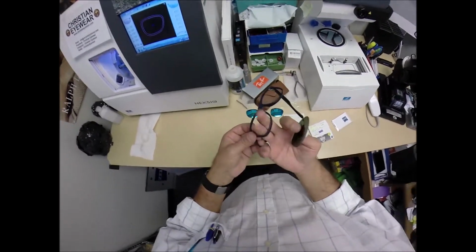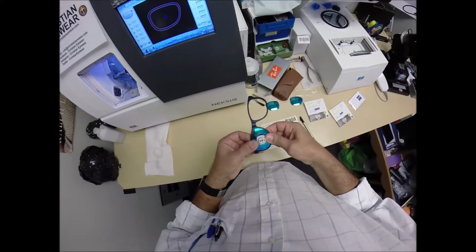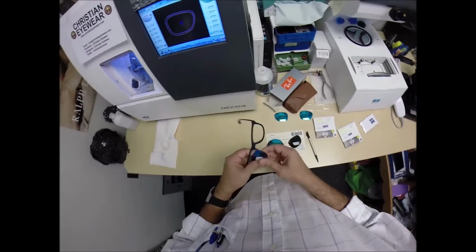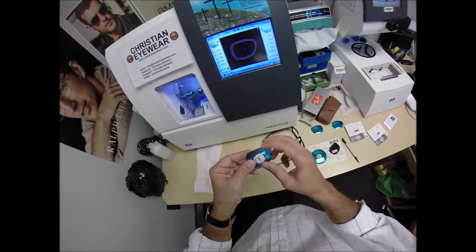I'm going to tuck it in on the side I have closest to me, and when I push down with the nose, I don't think it's going to go. Nope. So I'm going to take this down based on the size, 0.2 millimeter. I may need to do more.